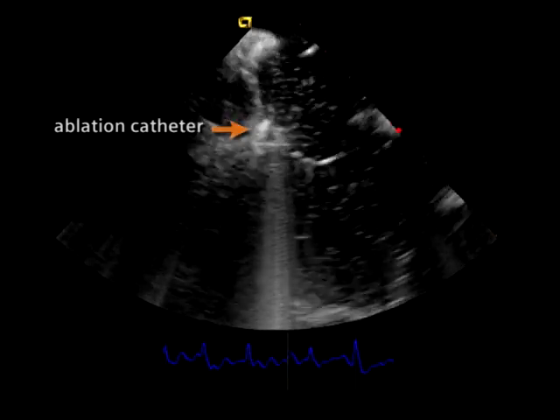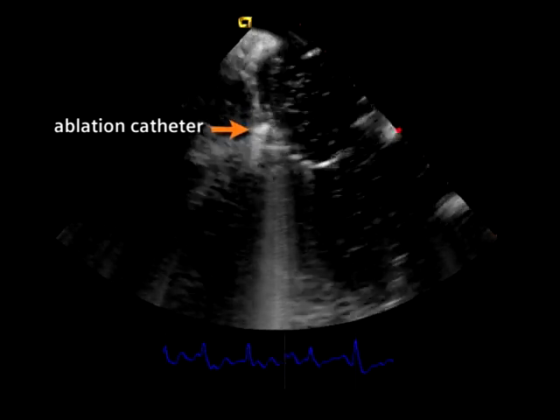There are times when ultrasound imaging is favorable for imaging the catheter ablation procedures done for atrial flutter, particularly in the setting of anatomic abnormalities. And such topics as catheter contact of the ablation catheter on the right atrial surface can be documented by ultrasound examination.